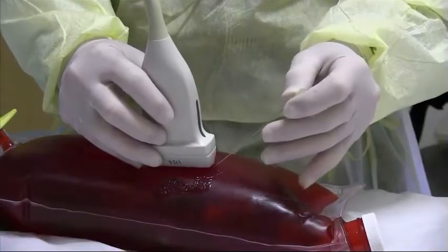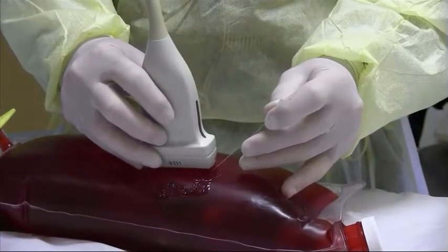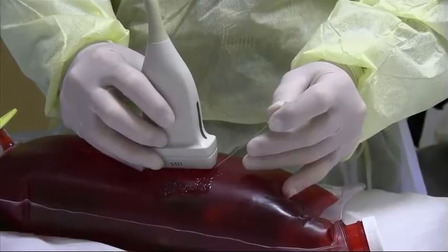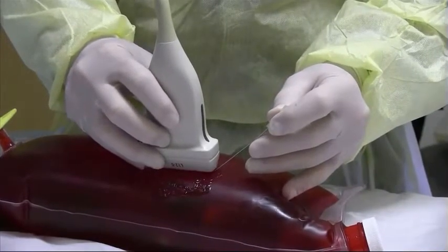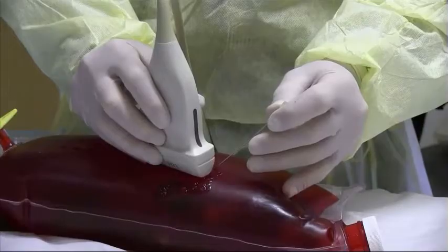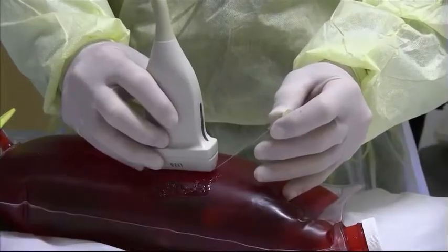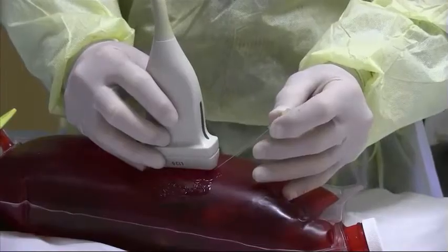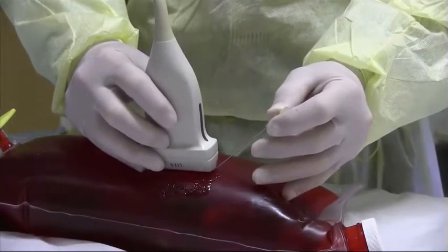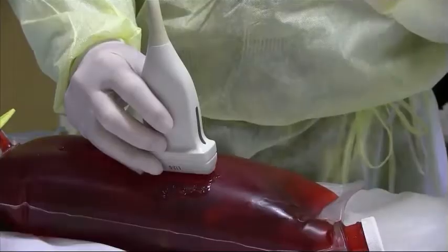If you're having trouble finding your needle once it's in, puncture and go in first, then holding the needle steady, slowly go back and forth with the transducer keeping everything parallel. The mnemonic I use: if everything's in line, you will see just fine. If you start drifting off or angling the transducer you won't pick up your needle. Don't move both the needle and the transducer — keep the needle steady and slowly scan back and forth until you find it. Use the highest frequency transducer that can penetrate the patient for best resolution, and set your focal zone at the level of the nodule.